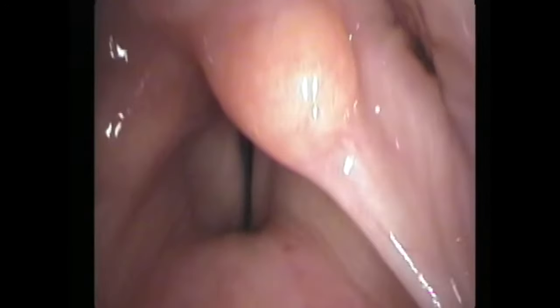I think a reasonable initial first take on this is that there's dyskinesis. The left side's not moving normally. In fact, it probably looks like synkinesis here in that it's not moving much at all, but it holds its own when she goes to make sound - so it certainly has tension in it. I'm able to hear some white noise each time she breathes inward. And when I ask her to take a deep breath, we see Bernoulli effect creating that white noise - the left membranous vocal cord draws inward on a deep breath because it's so close to the other vocal cord.